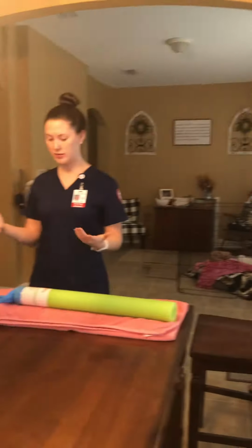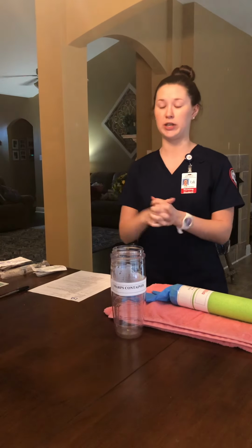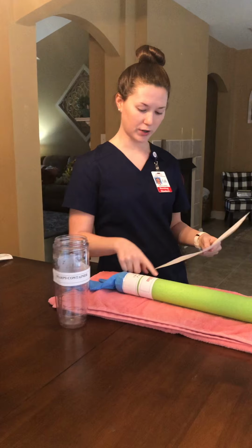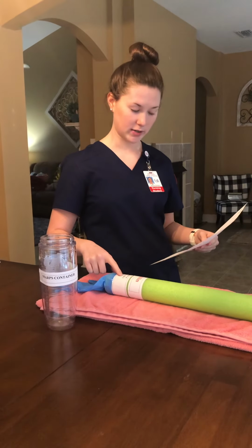So the first thing I would do is verify the order in the hospital policy. After doing that, I would gather my equipment and then perform hand hygiene. Next, I would verify my patient using two identifiers. So Jaguar J. Jones, date of birth 8/25/1963.